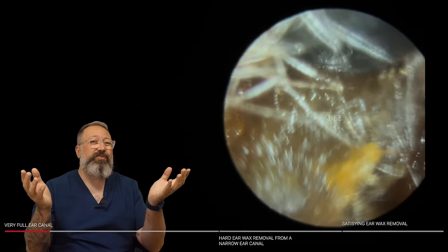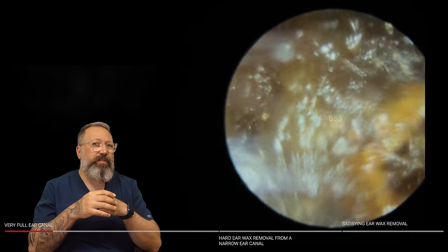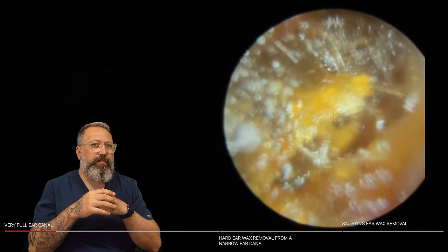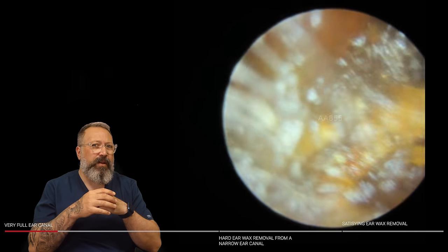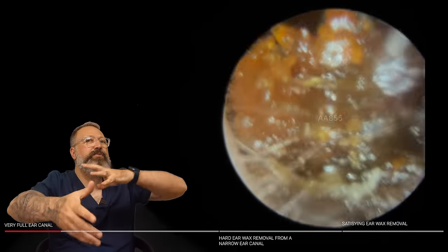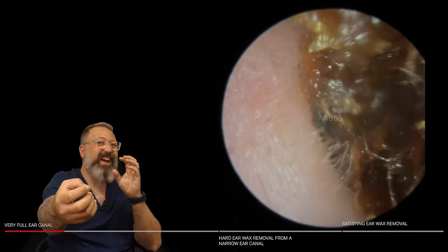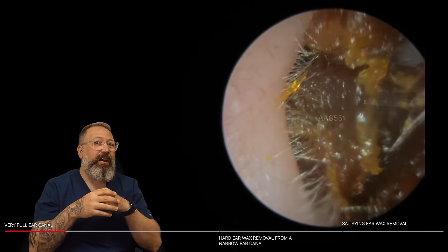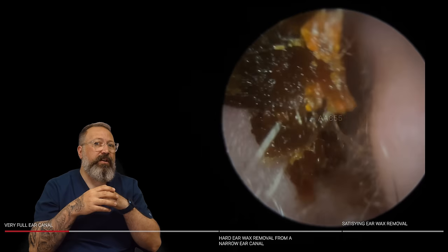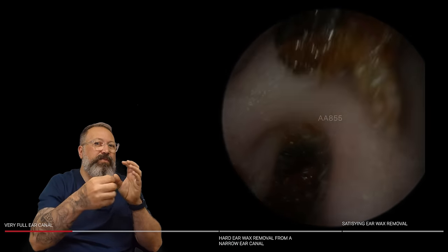So we've got the Jobson Horn. You can see it's not really budging with the suction tube at the moment. So let's go in with the Jobson Horn — quite good for these kinds of soft waxes. It's super duper sticky though. As we get the Jobson Horn behind it, it's going to pull through. There you go — a nice chunky piece coming away. But watch how this comes through now — it kind of almost stalls and gets stuck. That's because it's so sticky; it's still attached to the wax beyond it. So we're just pulling this next chunk through. A very, very full ear canal on this one.